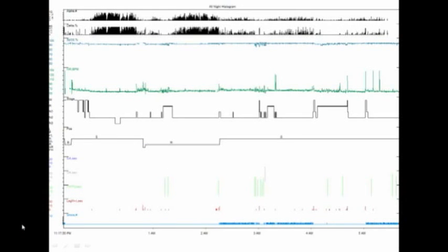You can now clearly see that whenever this person is getting any kind of delta sleep, there are significant alpha wave intrusions. Now, for something that some sleep specialists say they've never seen before or don't believe exists, I think it's pretty easy to identify alpha delta sleep in this patient with fibromyalgia.